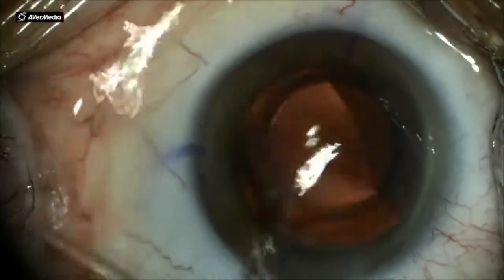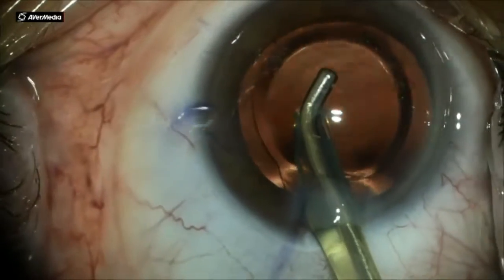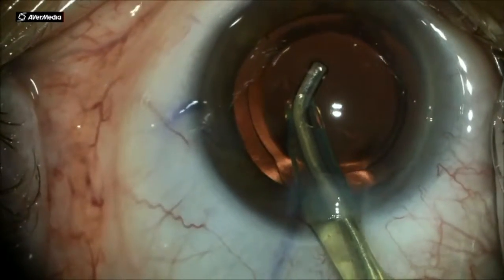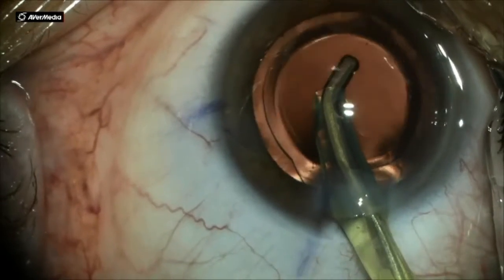The complete removal of the OVD is very important in all implants, especially in toric implants. This is a toric implant, one-piece acrylic.